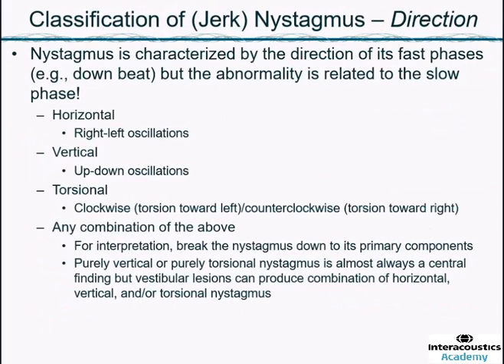The next characteristic of the nystagmus that you should determine is the direction. Remember that it's not correct to say the nystagmus is right or left. You always have to specify whether you're talking about fast phase or slow phase. Traditionally, we characterize the nystagmus by its fast phases. This is because in the old days, when you looked at the patient's eyes, what caught your eyes was the fast phase of the nystagmus.